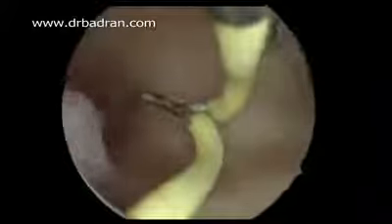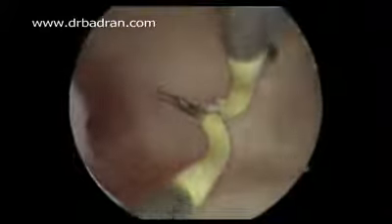Hello, this is a case of a shallow, wide uterine septum that connects the upper anterior part of the uterine wall to the posterior part of the uterine wall, involving probably the upper third of the uterine cavity. It was the only identifiable cause for the patient's recurrent miscarriages, and so we are performing resection of this septum in hope to improve the pregnancy outcome in the future.